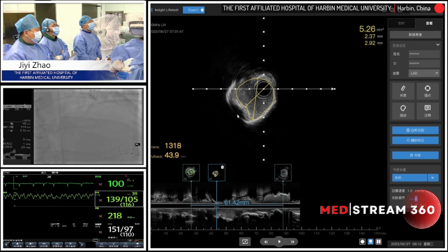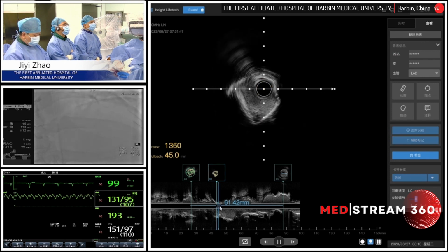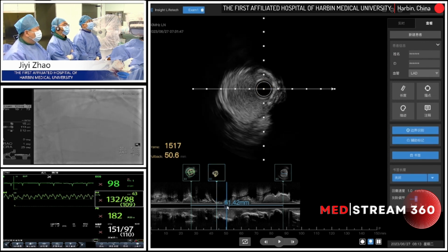So I think in this kind of situation, I don't think rota is going to play a great role in this patient. So how to treat this kind of relatively large angle superficial circumferential calcification is a good question. Let's see the rest of the pullback from the LAD.